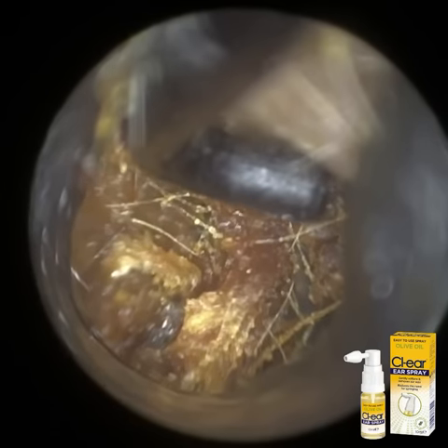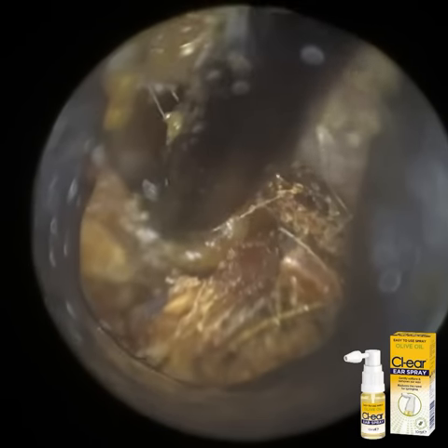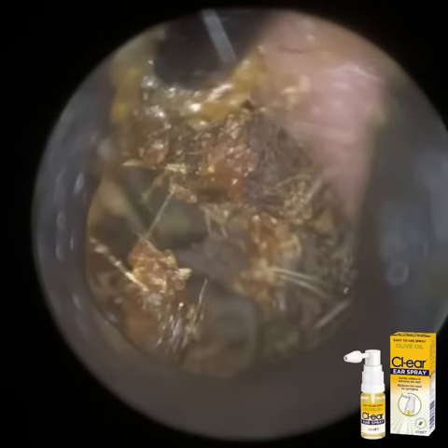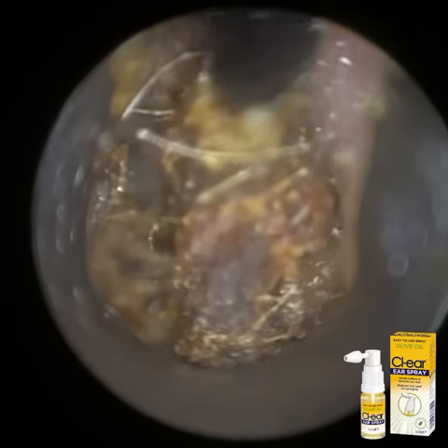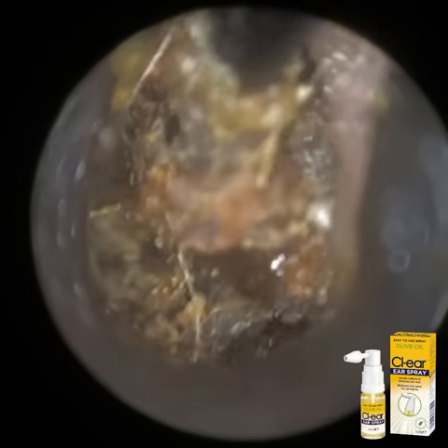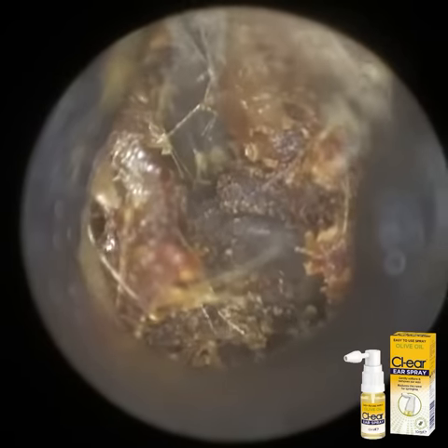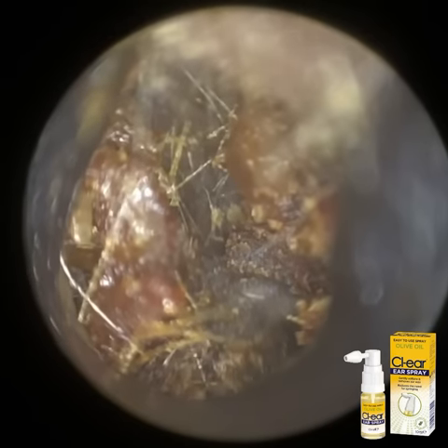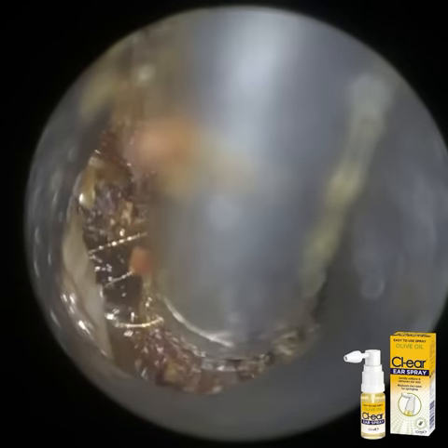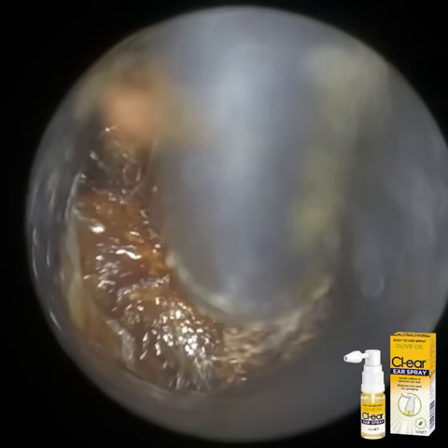So once again, I've just angled the WAXscope to face the roof of the ear canal. I've used the ear hook again, just glided it into the core, and just like the first instance, although the hook isn't bringing the wax plug out as I was hoping, it's still dissecting it into smaller pieces. I'm just going to be very careful that as we're retracting the hook, we're not embedding the hook into the surface of the canal wall and grazing it. It's going to be very traumatic for the patient and can obviously cause injury, trauma and bleeding.